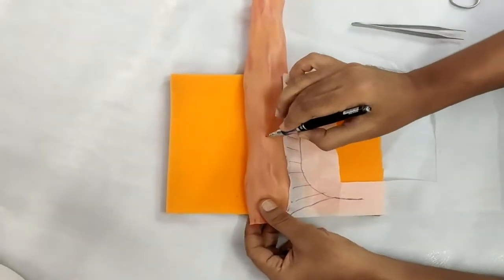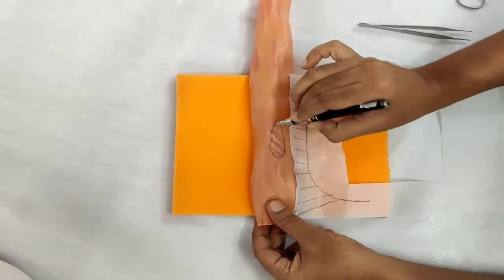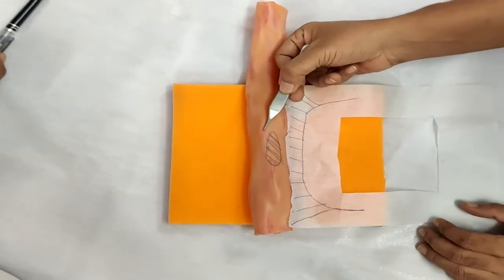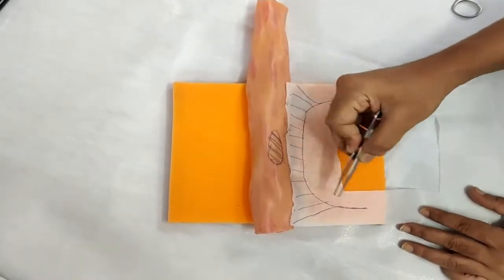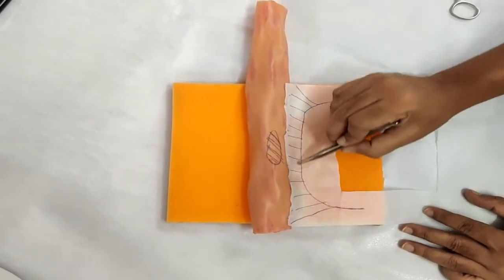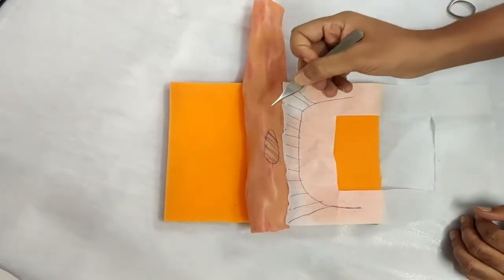As you can see, we will mark our diseased segment on the intestine and consider it for resection. The intestine is attached to a mesentery with its blood supply. Considering this as a vascular supply and vascular arcade, there are certain basic principles we need to keep in mind.